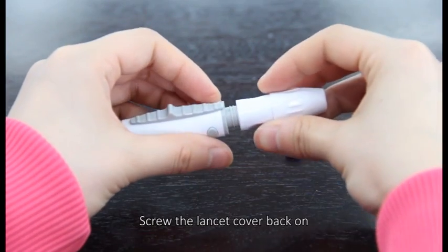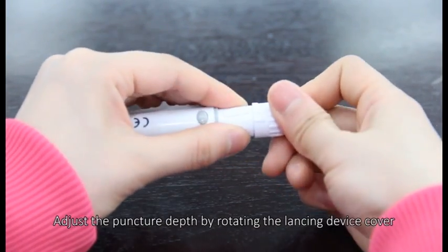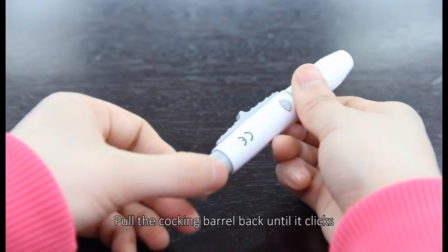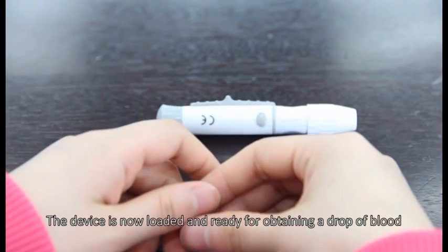Screw the lancet cover back on. Adjust the puncture depth by rotating the lancing device cover. Pull the cocking barrel back until it clicks. The device is now loaded and ready for obtaining a drop of blood.